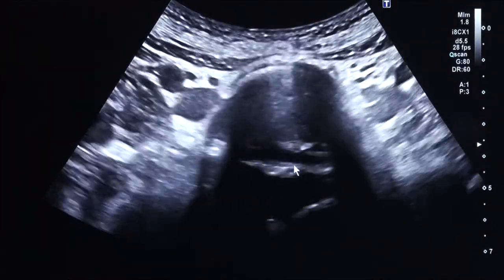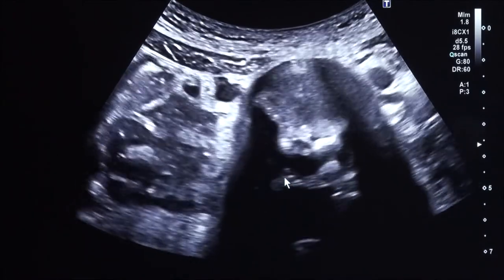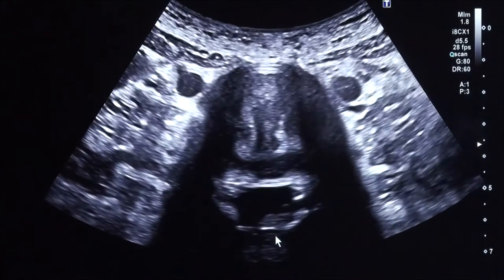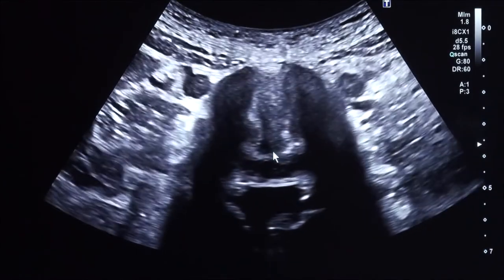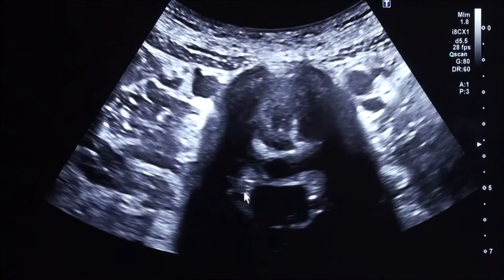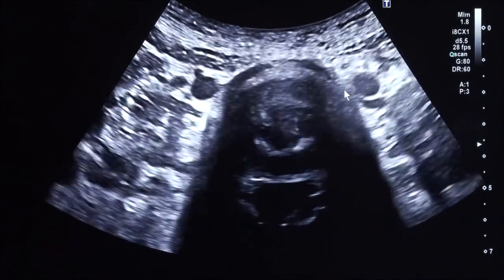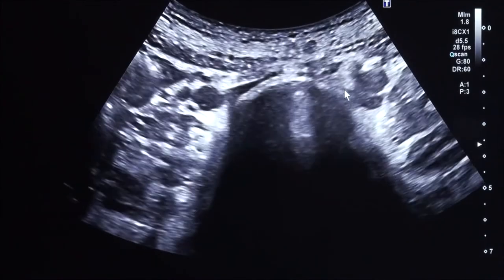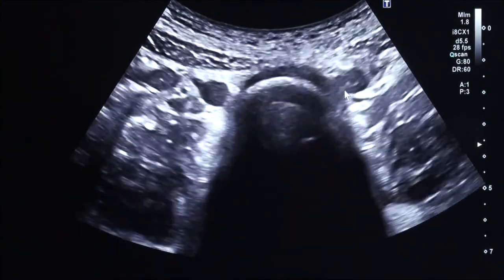Moving on to the adjacent segment, L4L5 — right here. You can see that this segment is better, not perfect but better. You can see how flat the rim of the annulus is. There's still some degeneration but the foramens are normal, so this is a better segment than L5S1 on this person. We see the iliac arteries right here, which is how we know we're at L4L5. The beauty of this compared to MRI is that if I ask the patient to bend, I can see the protrusion become larger — which is not possible with MRI because MRI is static.